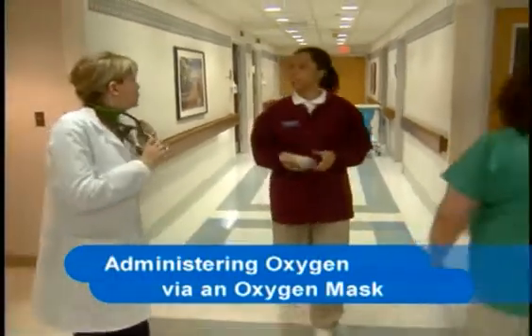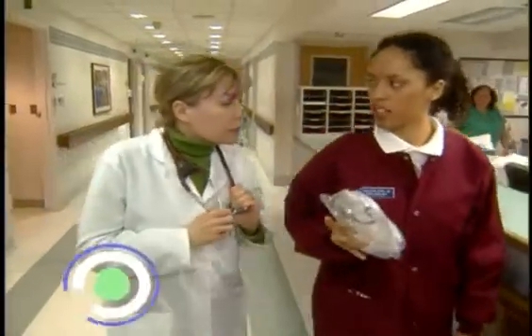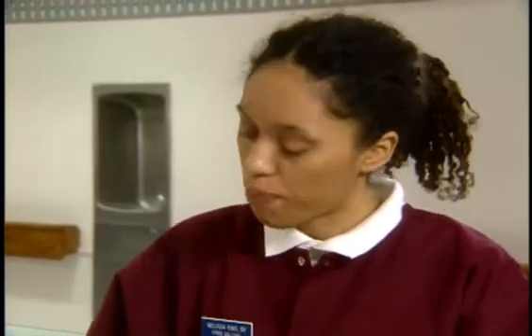Oh, someone's on the move. I was just looking for you. Can you help me apply a partial rebreather mask? Of course. What's the situation? Well, my patient has had some changes in his respiratory status, and his oxygen saturation has dropped to 89%. So his nurse called the doctor, who ordered a mask with an oxygen flow rate of 10 liters per minute.